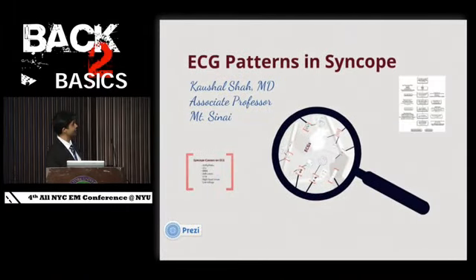You have to look at an EKG in context, which is the most important message today. So if you look at an EKG and look for ST elevations, T-wave inversions, it doesn't make sense if the guy's 21 years old and has a syncopal episode. So you really have to think about context. A young patient with syncope, you're going to look for delta waves and prolonged QT and things we're going to talk about, but you wouldn't do that necessarily in the older patient with chest pain. So again, context is everything.